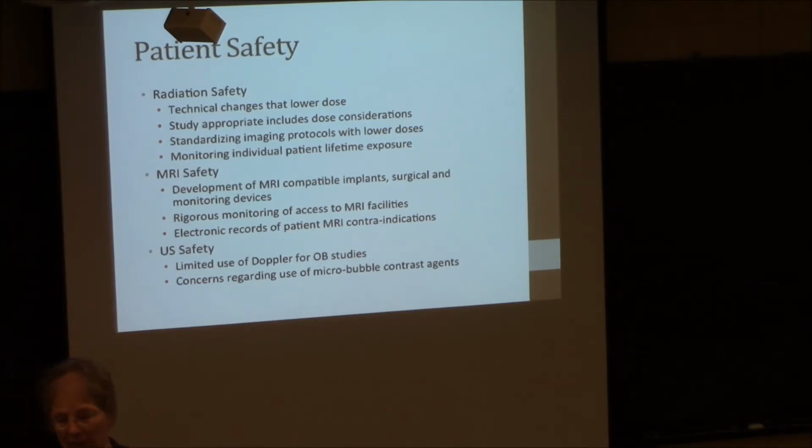Ultrasound safety, interestingly enough, has sort of come into the fray, only because with OB studies, if we do a lot of imaging, sometimes in early trimesters, there's some concern about the fetus because of heating issues. And then there are now being introduced some contrast agents to be used, which we've never done in ultrasound before. And contrast agents in ultrasound are generally microbubbles. And the thing about ultrasound is it's a mechanical vibrational wave. And if you start bubbles vibrating, they can break and explode and cause bioeffects. And so that's been the issue. Microbubble contrast agents are not FDA approved yet in the United States, though they're well used in Europe at this time. But eventually they will be, and then there are a lot more precautions that we'll have to take.